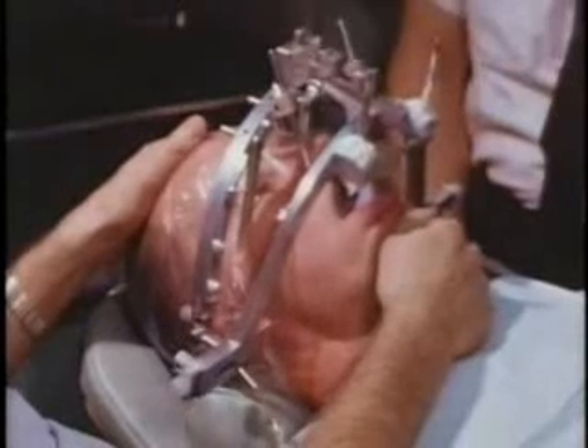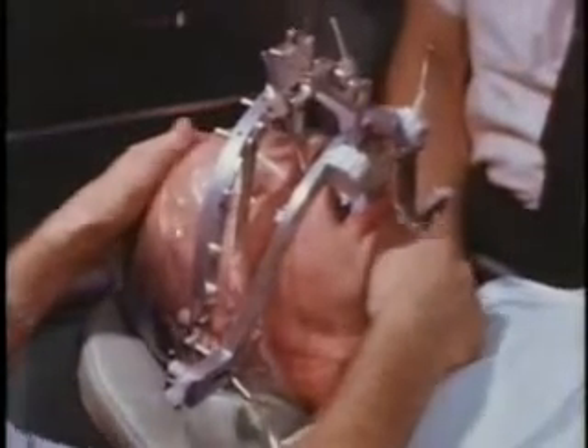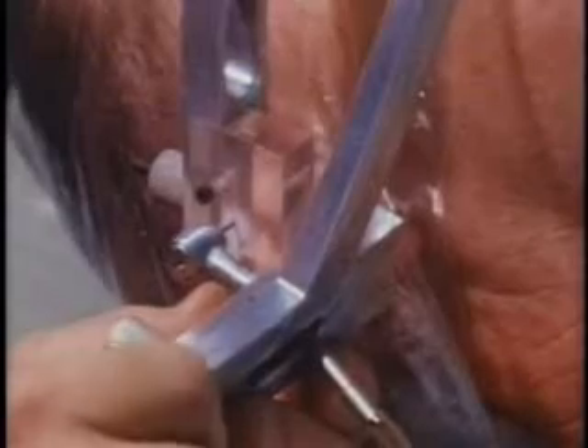The mandible is again placed in centric relation in preparation for recording the movements of the hinge axis. With the mandible in centric relation, the two axis drills are made to penetrate their associated recording blocks at a predetermined depth as indicated by calibrations on the turbine carriage. The turbine carriages are locked when the drill tips are precisely at the standardized distance of 220 millimeters apart.